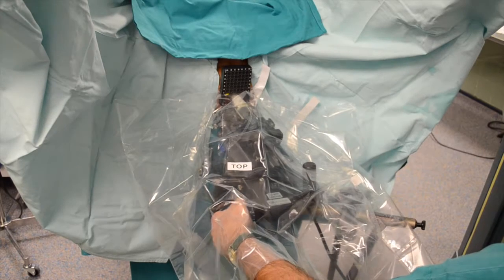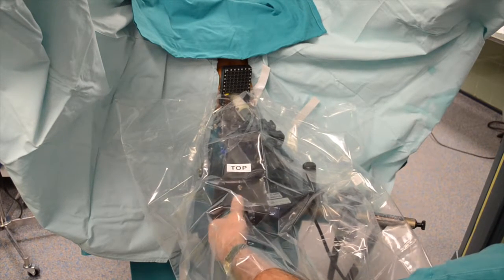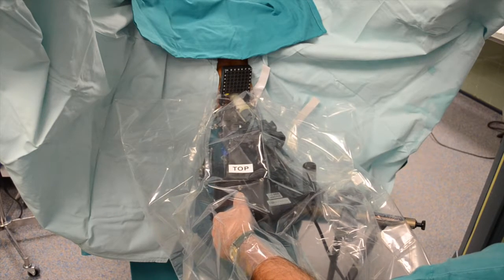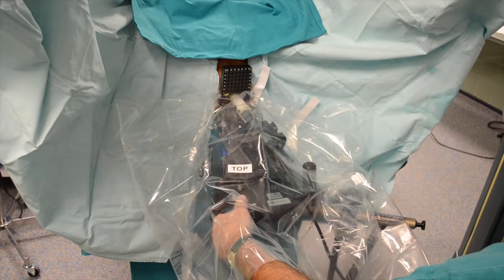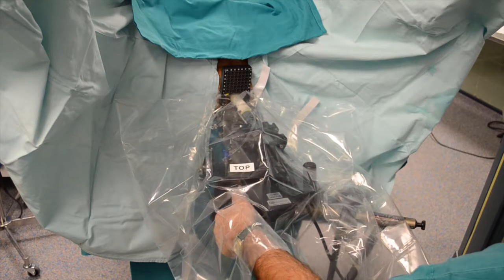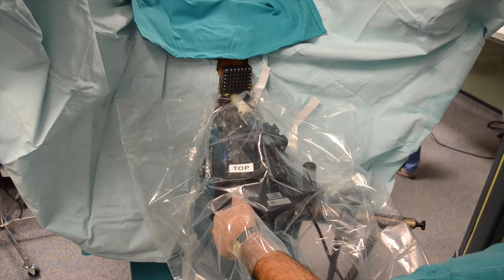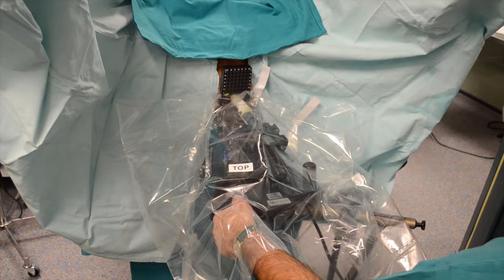The patient is placed in the dorsal lithotomy position and the ultrasound probe and the stepping device is inserted into the rectum. The urologist captures images in axial starting from the base and working his way to the apex, while at the same time those images are captured on the laptop.